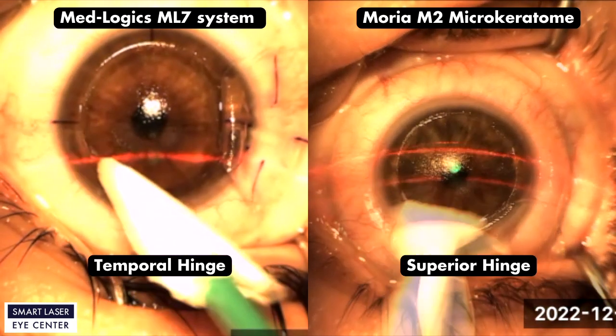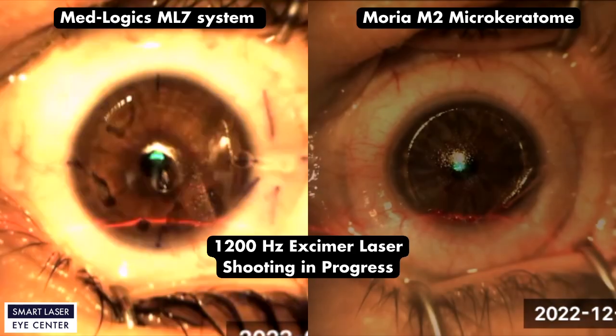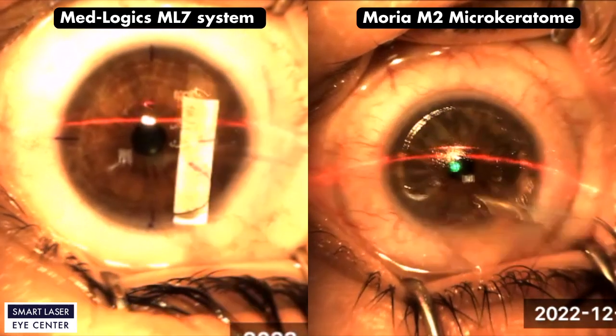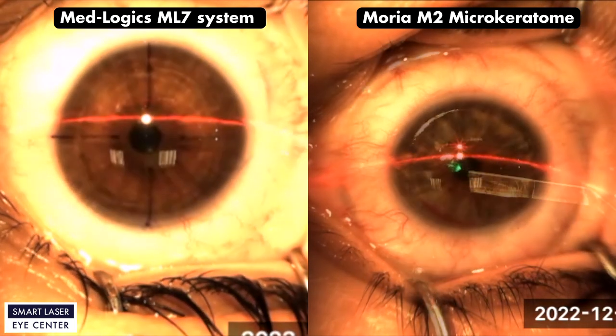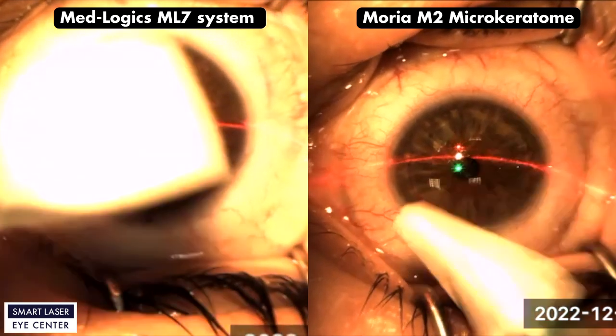Both eyes' stromal beds are looking good and dry for the laser shooting procedure. After the laser shooting procedure, the surgeon is washing the eyes and cornea flap, which needs to be put back in place gently. The surgeon did a great job without any complication.